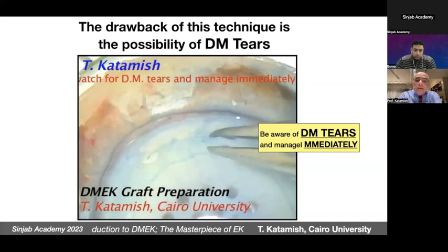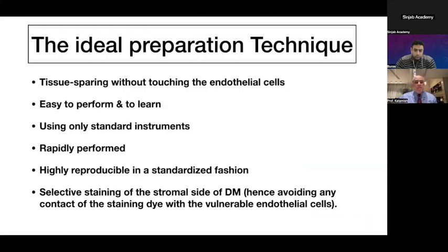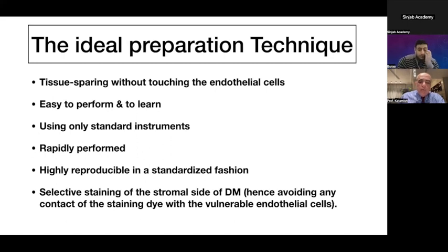Starting the dissection from the periphery allows us to deal with peripheral tears before they extend centrally. The ideal preparation technique should be tissue-sparing without touching the endothelial cells, easy to perform and learn, using only standard instruments, rapidly performed, and highly reproducible. Another important criterion is selective staining of the stromal side of the Descemet membrane, avoiding any contact of the staining dye with the vulnerable endothelial cells.